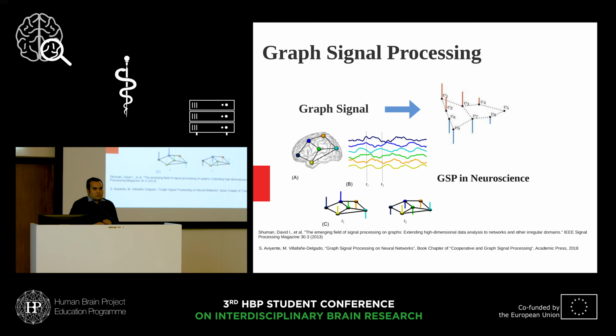The method that we used to study these patients is graph signal processing. Simply saying, what is a graph signal? When you have a weighted graph, and you put some values on the nodes of the graph, you will have a graph signal. In neuroscience, we usually use time series instead of just specific values. So we put time series on the nodes of the weighted graph, and at each time point, we have a graph signal for analysis.